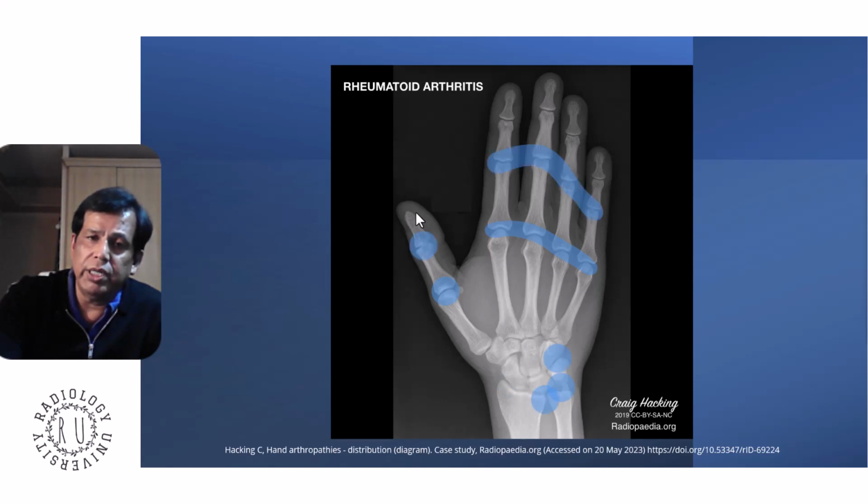Rheumatoid, distal and proximal, but mainly more proximal. It doesn't involve the very distal interphalangeal joint. MCP very common, wrist very common. Proximal involvement, symmetrical in about 60-70%. It could be symmetrical, female common. So the pattern of erosion, osteopenia, deformity, location: rheumatoid arthritis.